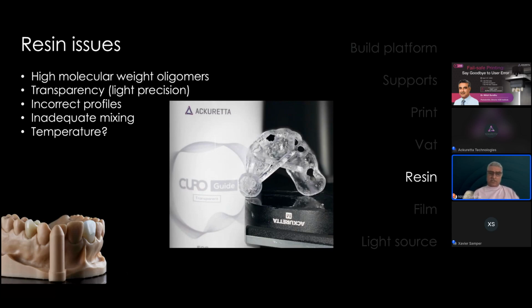The light passes through every layer, and it's very hard for the printer to kind of contain the energy down to a certain layer thickness in order to ensure that good curing occurs. So you do get these issues as well with transparent resins. It can also be because you selected the wrong, incorrect resin profile. You select these profiles, of course, when you actually slice your print, and you can select the absolutely wrong resin profile and then end up with a failure as well.